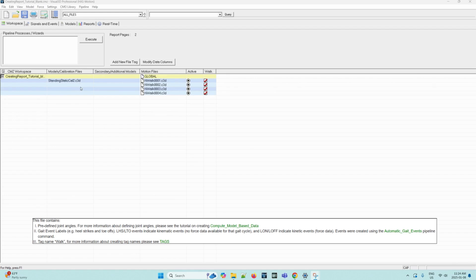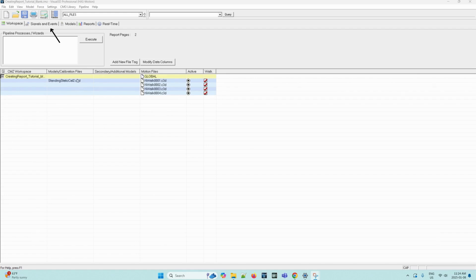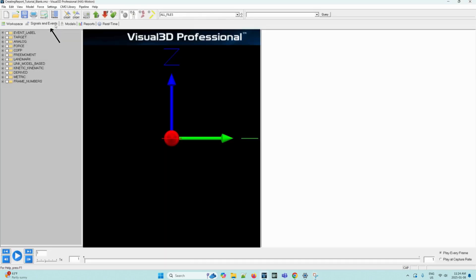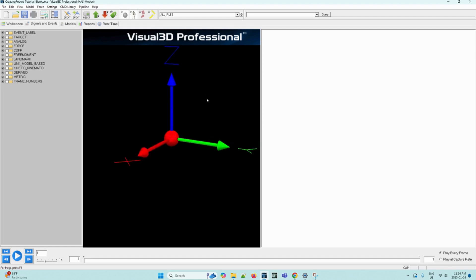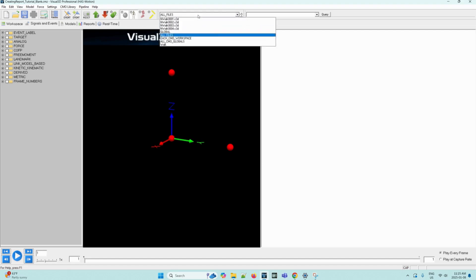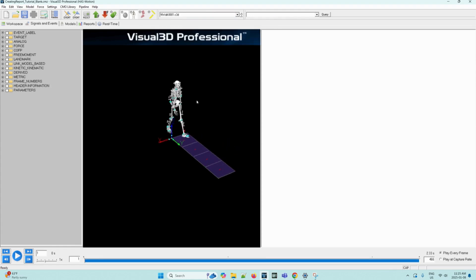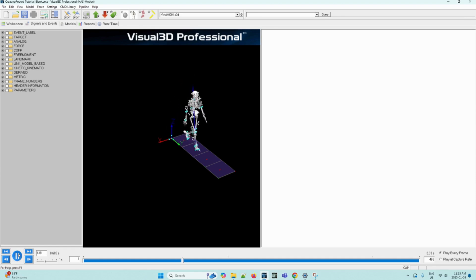Then we can navigate to the signals and events tab here to visualize the animation of the model based on the movement data and the model that was applied to it. If the animation isn't appearing in the 3D animation viewer, which in this case it's not, then we have to check the active file combo box on the toolbar, which is here. So we can click it and it will open a dropdown. It should read nwalk001.c3d, which is here, this file. Now we can play around with the VCR controls in order to view the motion capture.